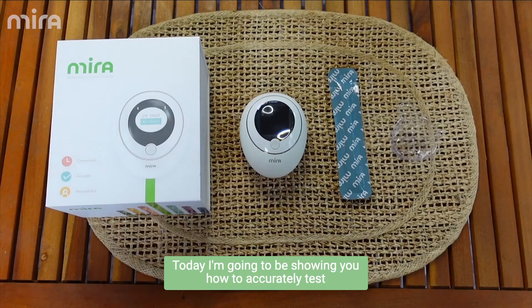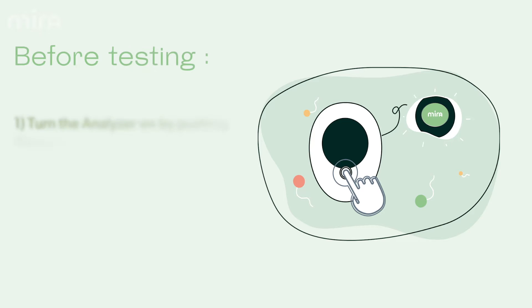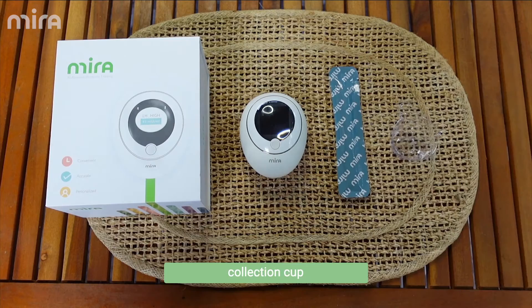Hey parents, today I'm going to be showing you how to accurately test with Mira. You're going to need your Mira device, a fresh wand, and a urine collection cup.